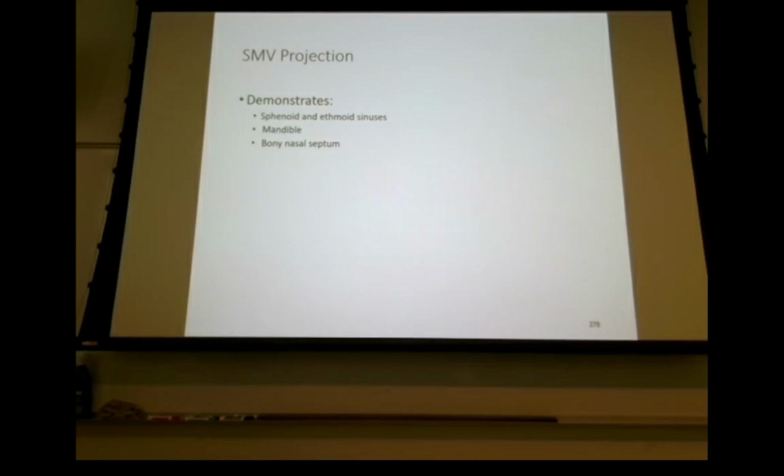Now this is where on the test it's going to be a little bit of a deviation because of the horizontal central ray. I think the answer on the test here is going to be central ray perpendicular to the IOML. So even on sinuses, you're going to try to accomplish IOML parallel to the image receptor, but if you can't get that, then your central ray still has to be perpendicular to the IOML, even on sinuses.